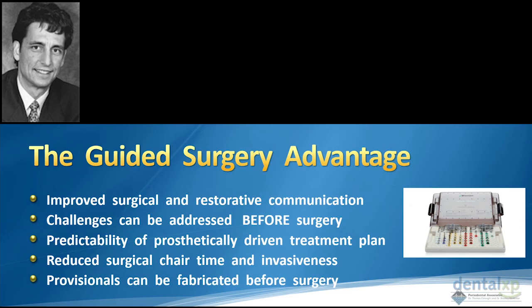You can also involve the laboratory because there are certain issues in regards to interocclusal space. We know if you're doing full arch restorations, you need to have adequate interarch space. All of these are things that can be vetted out with good preoperative planning utilizing guided surgery. And it's best to, again, address these all before surgery, and that way you can make it a very predictable treatment plan. You can minimize your chair time and minimize the invasiveness.